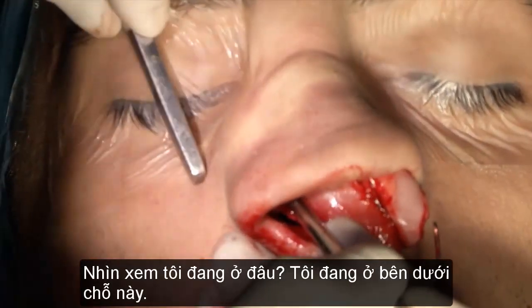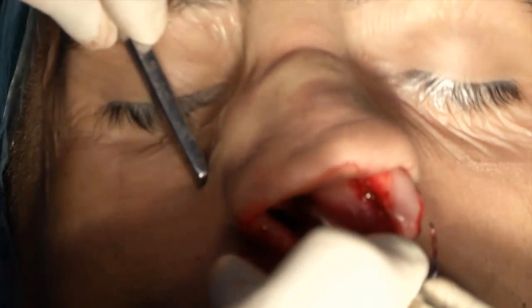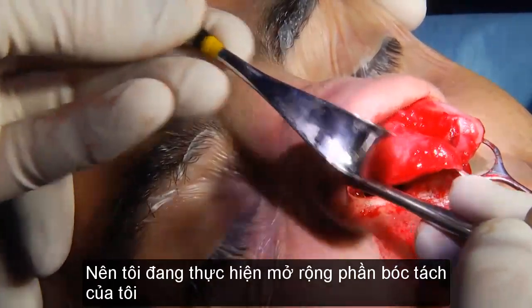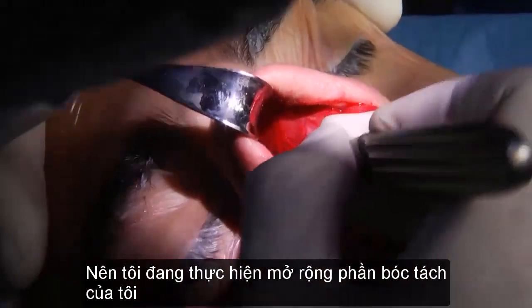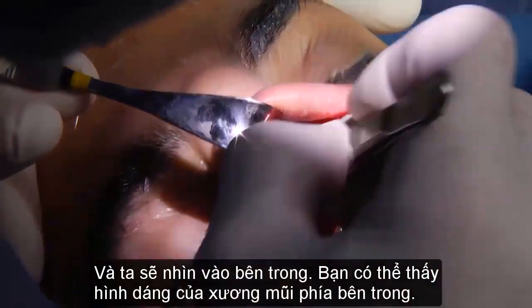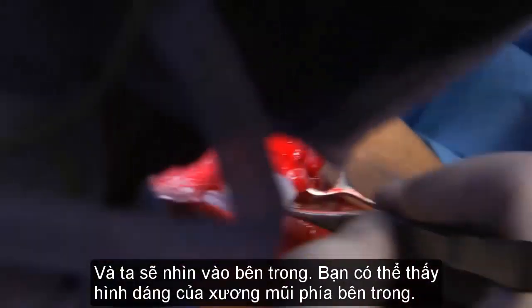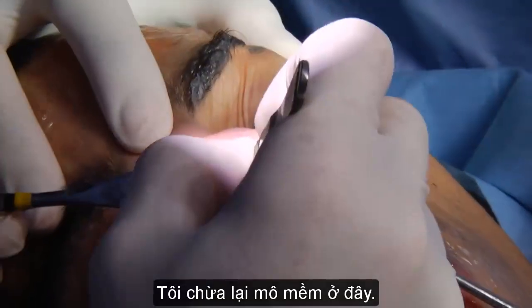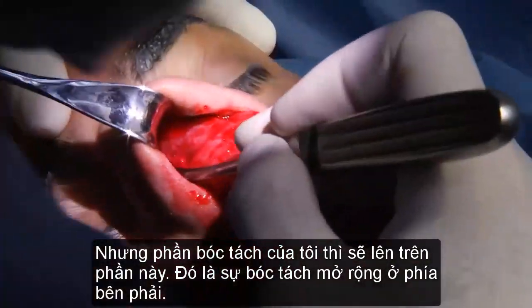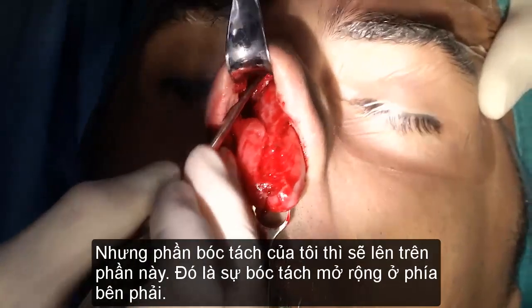I am already down here. So I'm really doing an extended degloving. And let's have a look at the inside. I can see the shape of the nasal bones all the way. All right, I left this tissue here, but my degloving is really up to here. So that's a wide degloving on the right side.